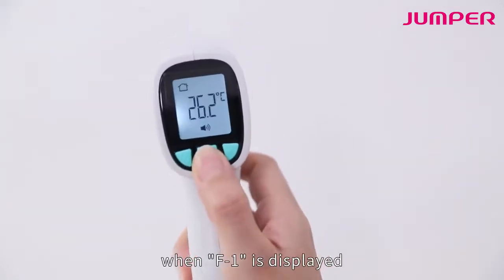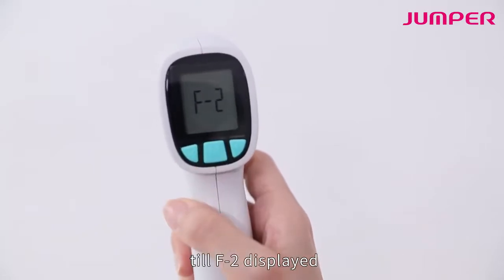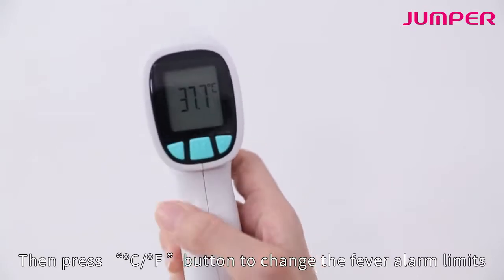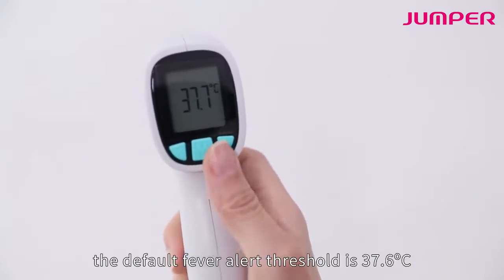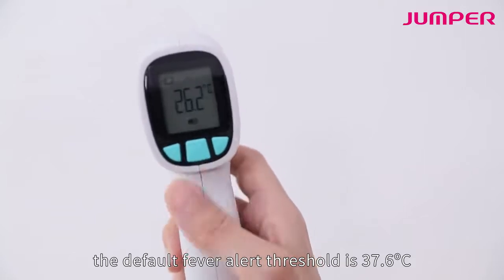When F1 is displayed, continue to press and release the mode button until F2 is displayed, then press the CF button to change the fever alarm limits. The default fever alert threshold is 37.6 degrees Celsius.